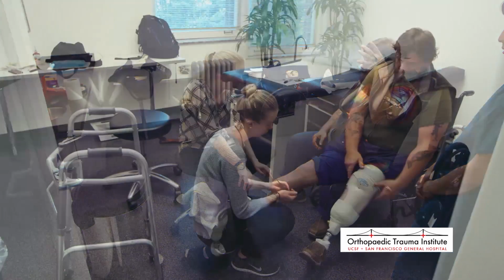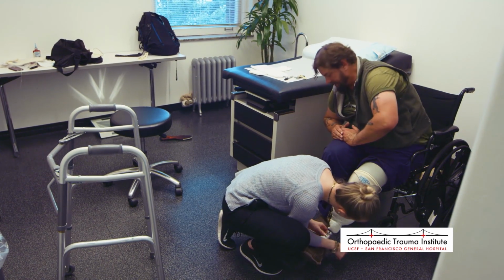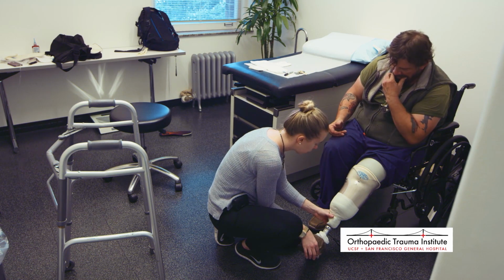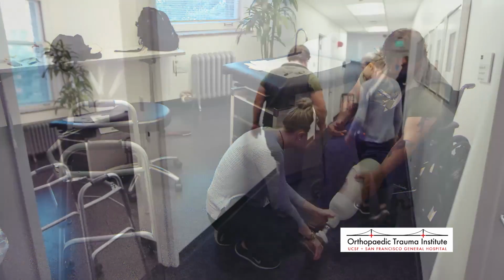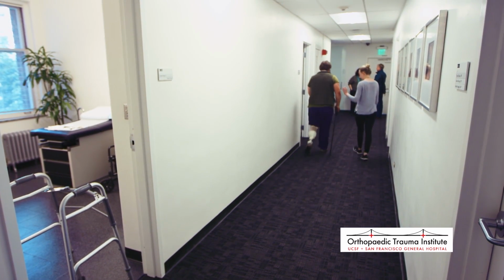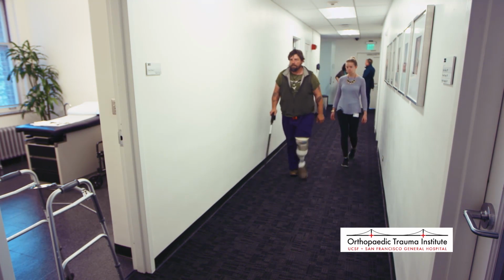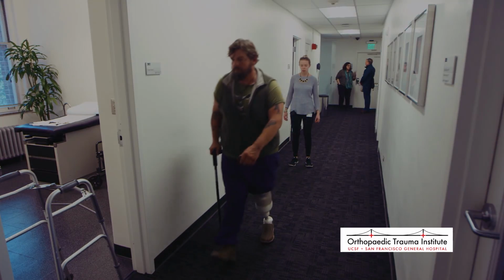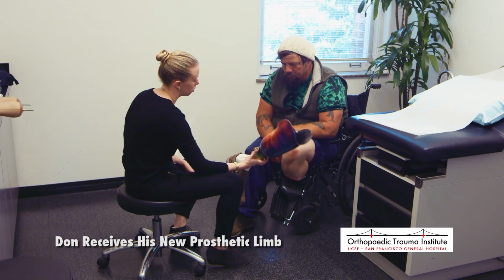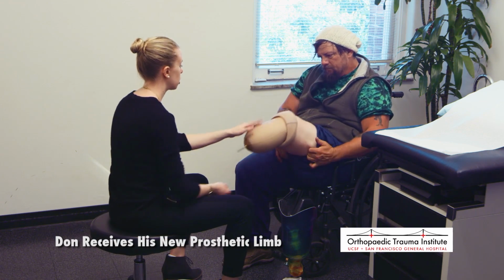Over the course of the next several visits, Hannah continues to adjust the test socket to more comfortably fit Don's residual limb. These visits also give both prosthetist and patient a chance to work together on fine-tuning all aspects of the prosthetic. It also gives Don an opportunity to continue to adapt to the new limb. Hannah has Don test everything from balance to gait to ensure that when it comes time for the final socket, everything is dialed in. After a handful of visits, and about 5 months after losing his foot, the day has come for Don to receive his finished prosthetic limb.